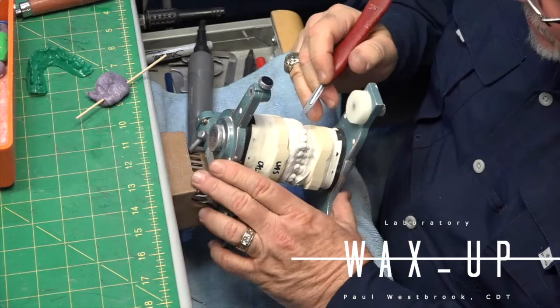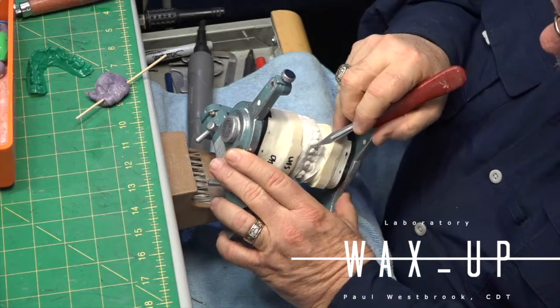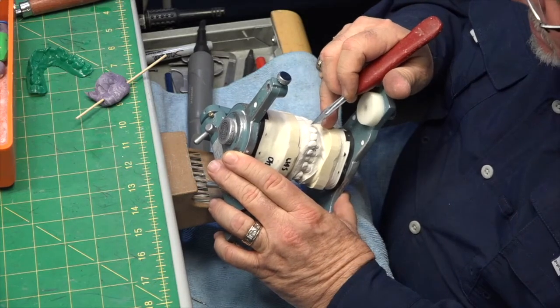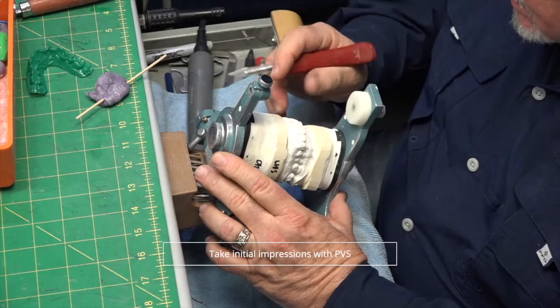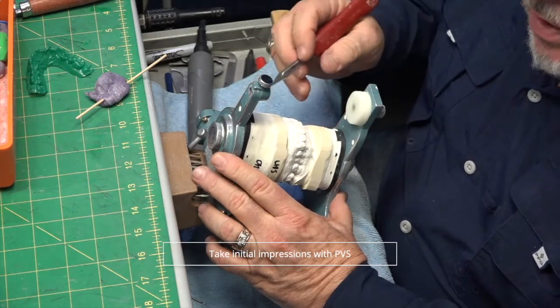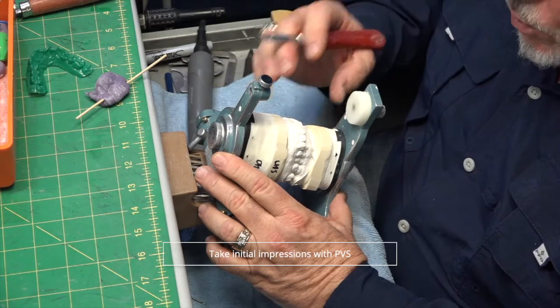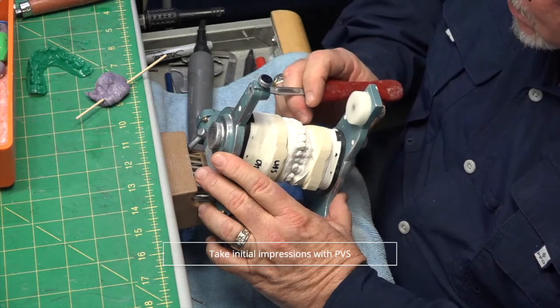One of the most important things whenever you're doing diagnostic wax-up work is to have really crisp architecture between the teeth and the gingiva in the doctor's impression and in your model. Any imperfections there create problems. So you always want your doctors to get really crisp gingival architecture, and then you're in good shape.